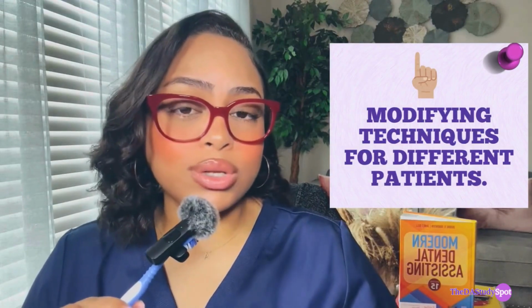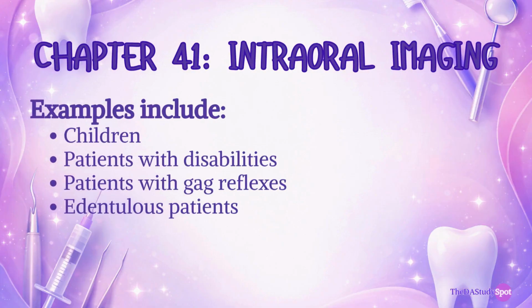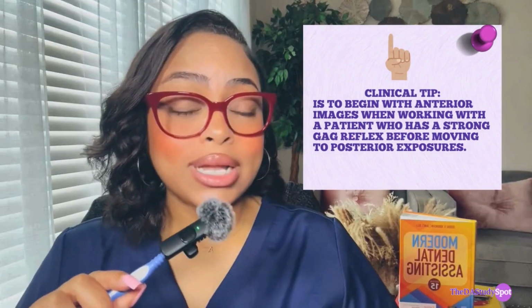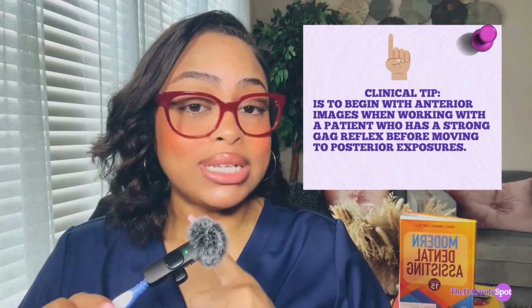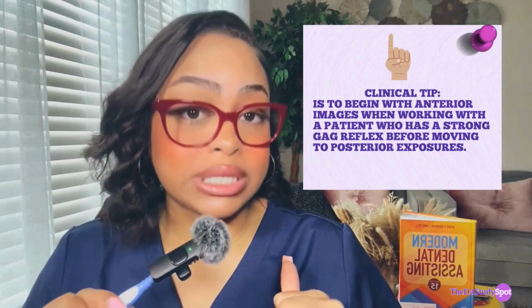Chapter 41 also discusses modifying techniques for different patients. Examples include children, patients with disabilities, patients with gag reflexes, and edentulous patients. One helpful clinical tip is to start with anterior teeth first when you have a patient that has a gag reflex before moving to the posterior teeth.